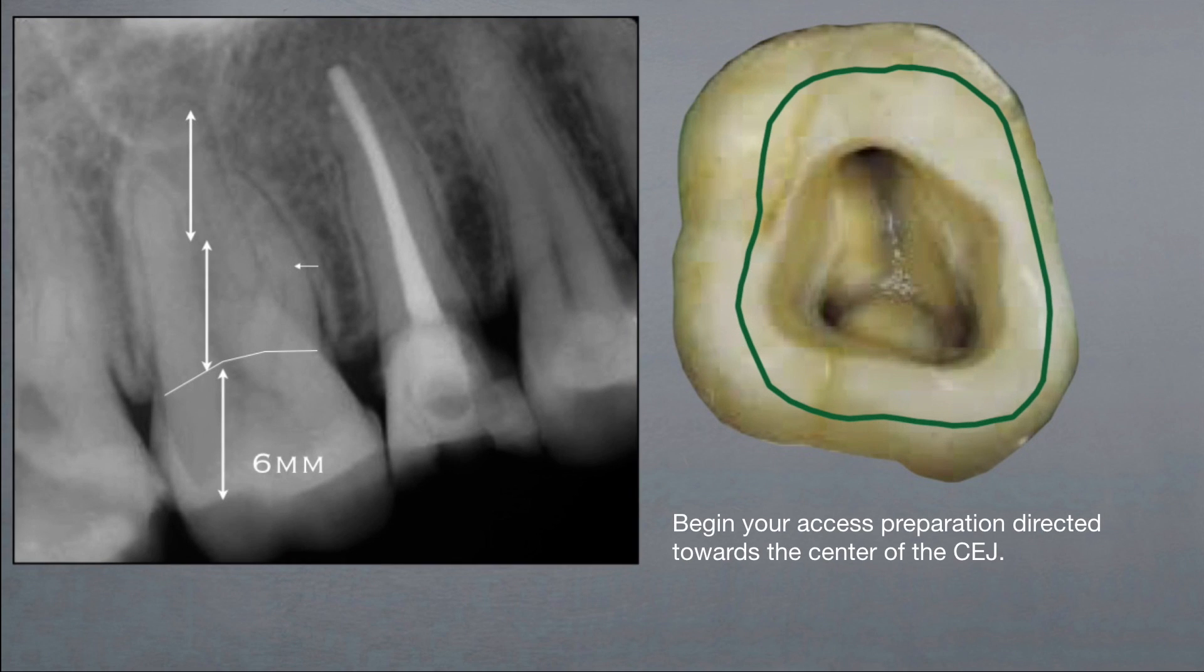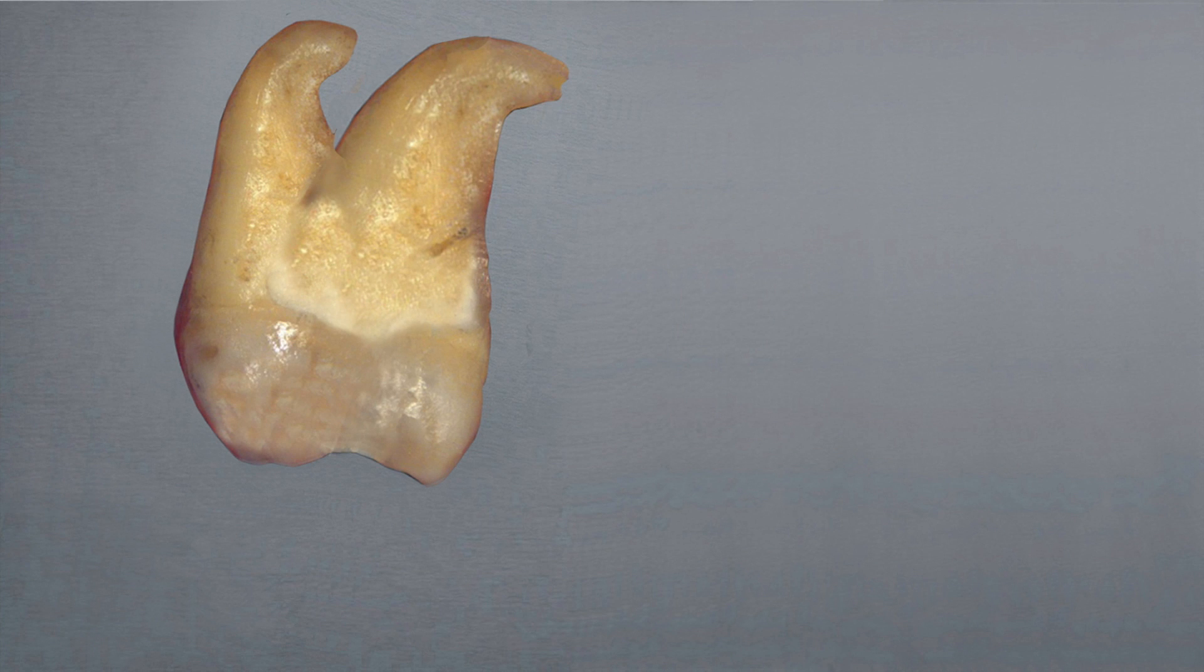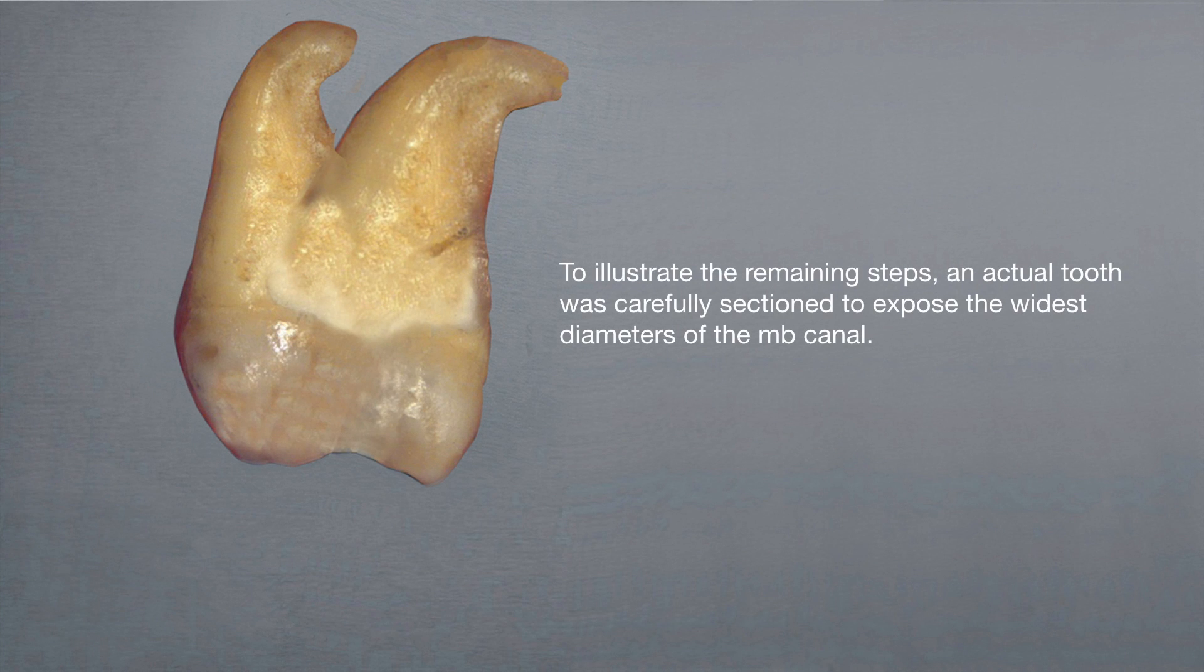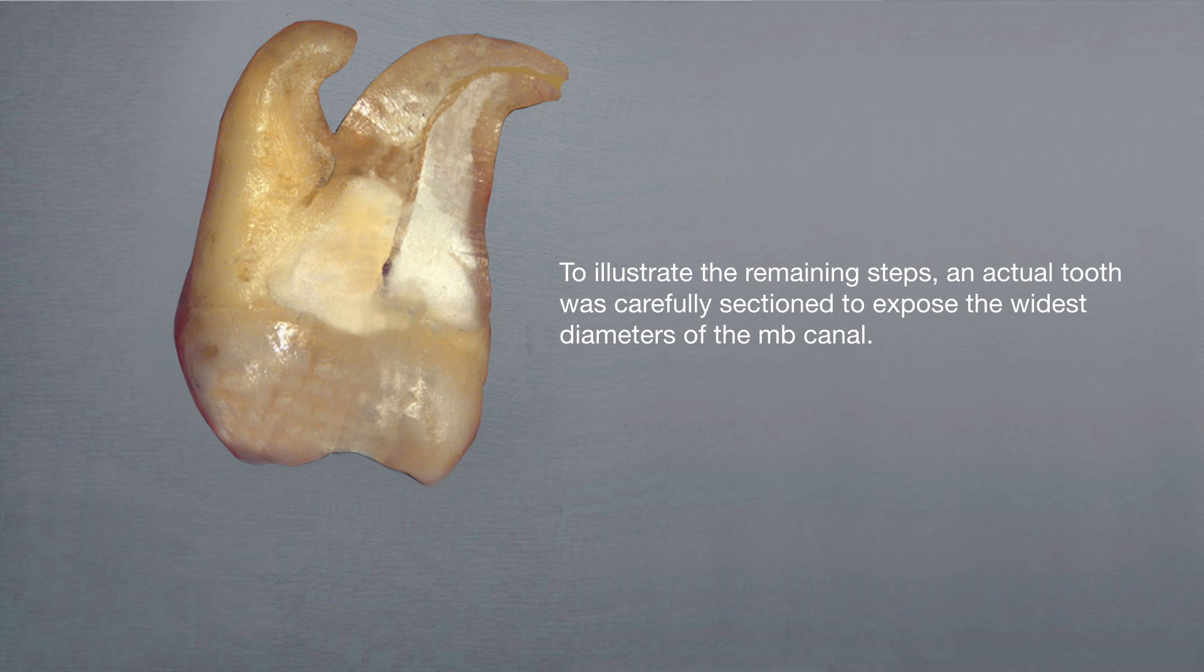Begin your access preparation directed towards the center of the CEJ. To illustrate the remaining steps, an actual tooth was carefully sectioned to expose the widest diameters of the MB canal.